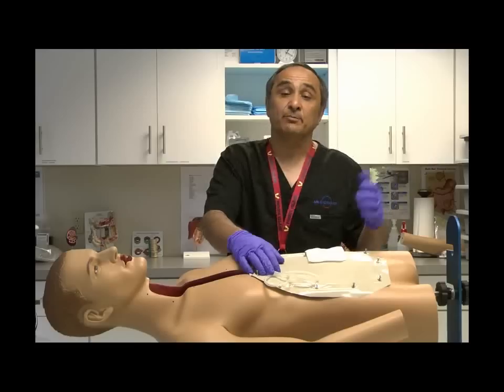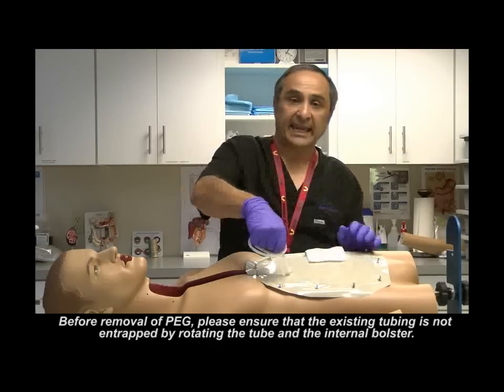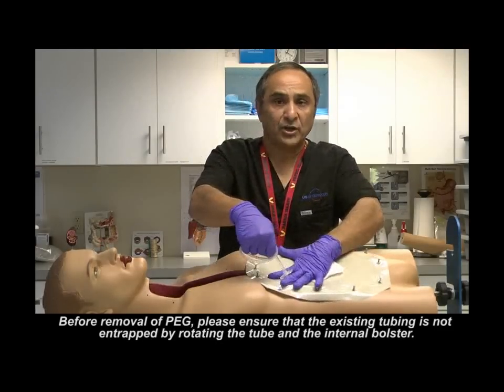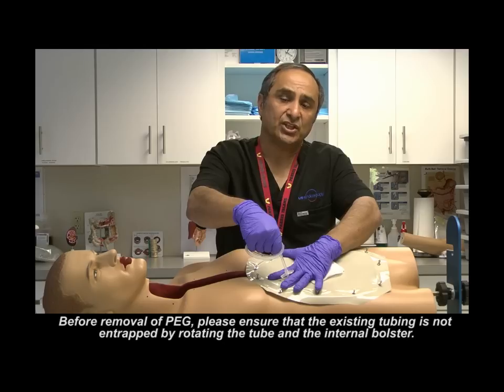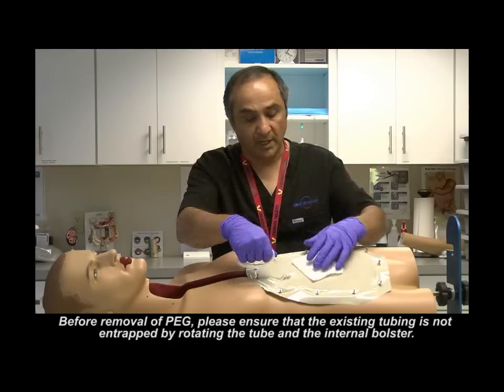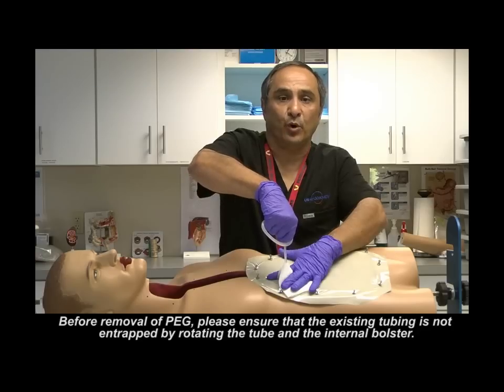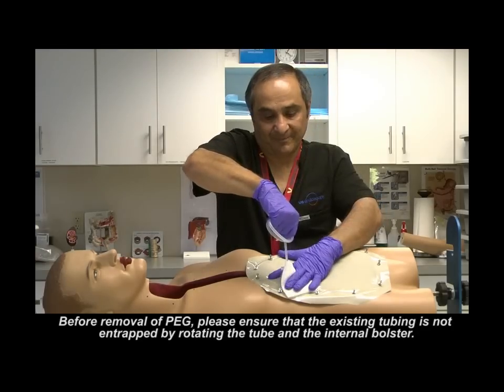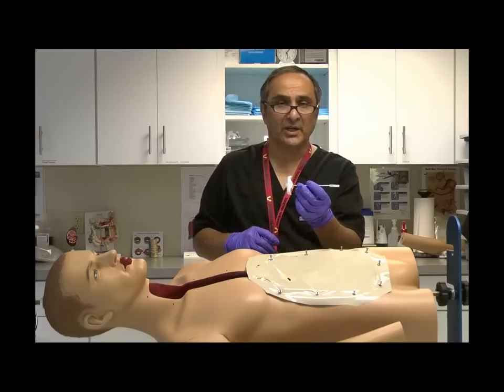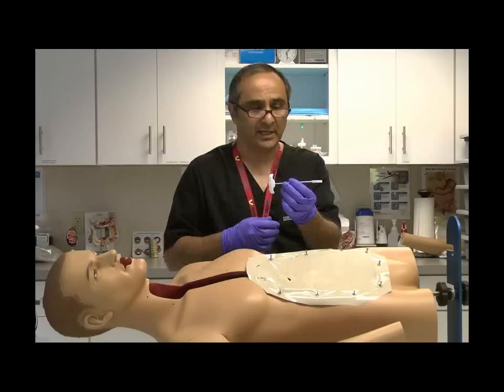So what I'm going to do now is simply demonstrate the technique. What I will do is just wrap the tube as much as I can around one hand. With the other hand, I'm going to put pressure here just to stabilize the patient's tissues and try to decrease any potential trauma of the tube coming through the tissue. Along with that, I'm going to use my trusty 4x4s to cover the site and then simply pull. Here we go. It's very simple.